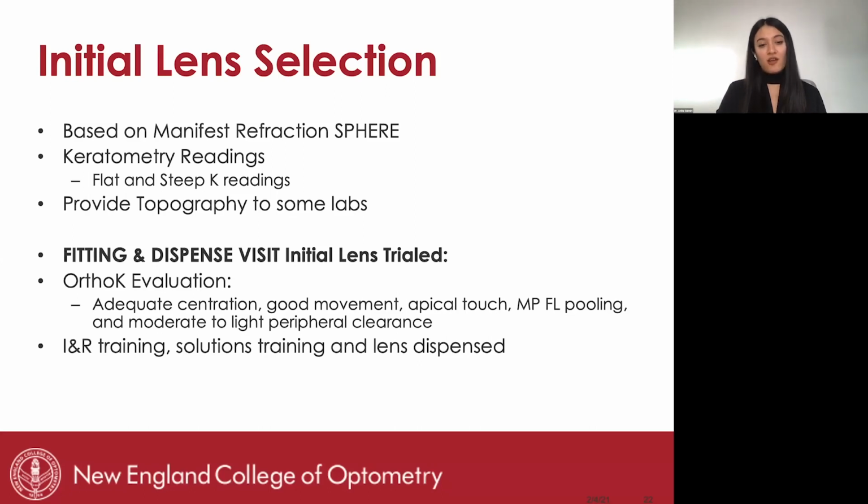So these manufacturers, I have to give them credit. They've gotten extremely good at designing lenses based on very simple things like your manifest refraction sphere and your keratometry readings. And most of the time, that first lens that I get is good enough where I can actually send them home.